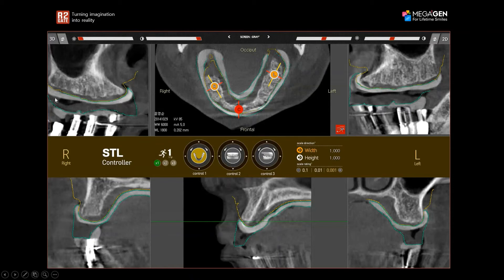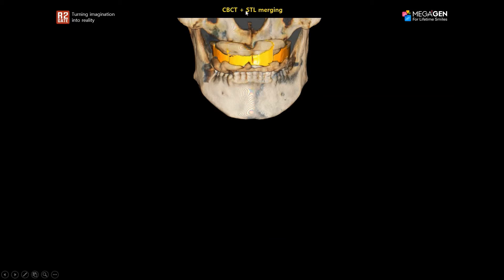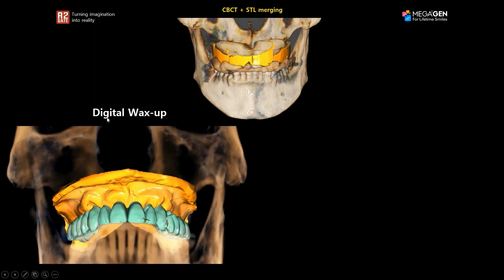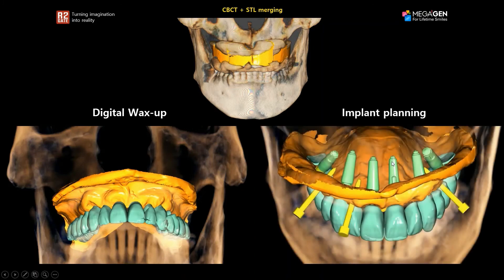This is how the base of the tray looks in a CBCT. Since it's a radiopaque tray, it's clearly visible, and the wax rim can also be seen. Now that I've matched the CBCT to the STL file through the merging process, I use the orientation reference lines for the midline and canine lines to design a digital wax-up. The digital wax-up helps me know exactly where to place the implants — always planning based on tooth position, keeping everything prosthetically driven.